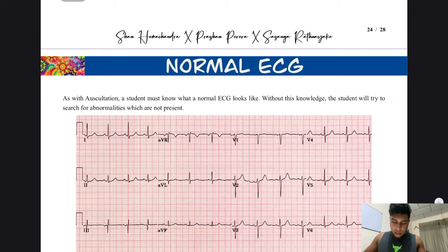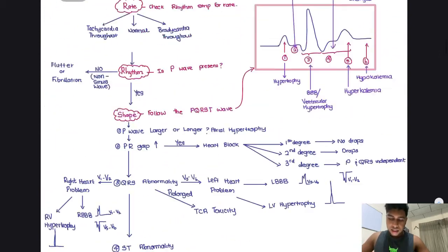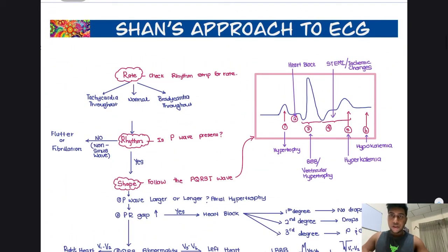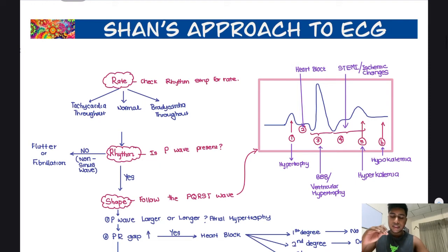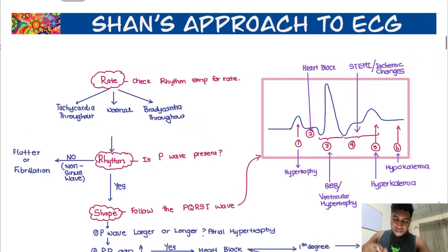So guys, I'm just going to do a summary of the lesson we did on reading ECGs. The first thing I want to tell you, this approach is something that I developed, something I have been using for a while, and it's basically a discipline so that I don't miss anything. Okay, I have 3 rules.